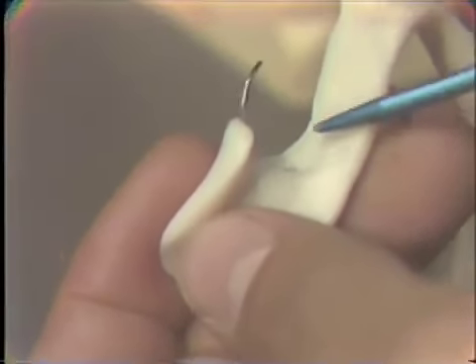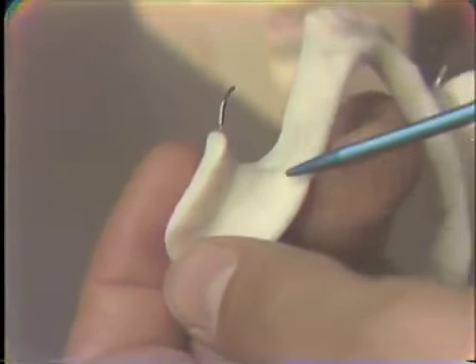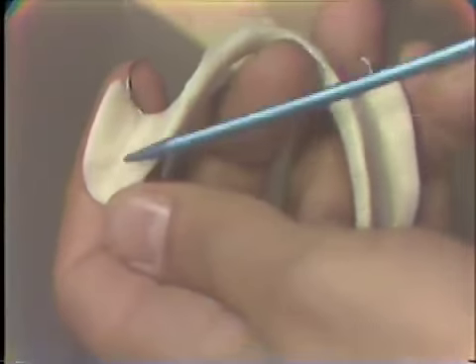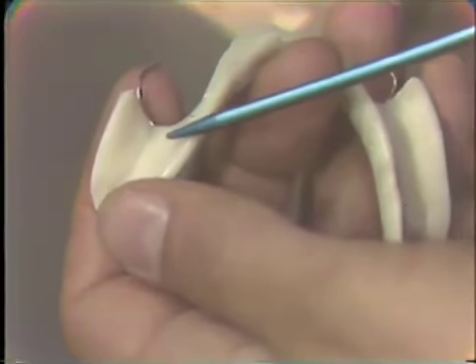If you have a slight burn through, such as we have in this area, that is of no consequence whatsoever, because the majority of that wire is embedded. And we see the undersurface of this side is also smooth and will not bother the patient.